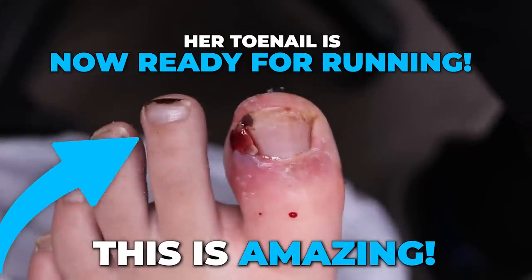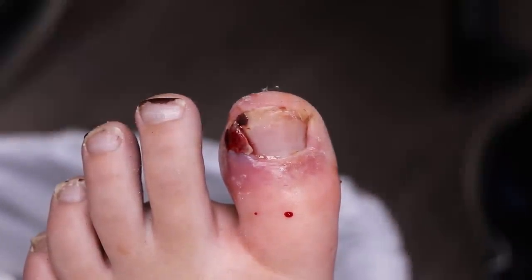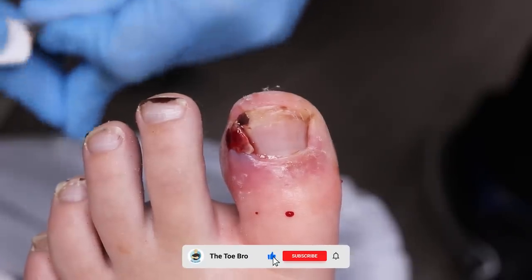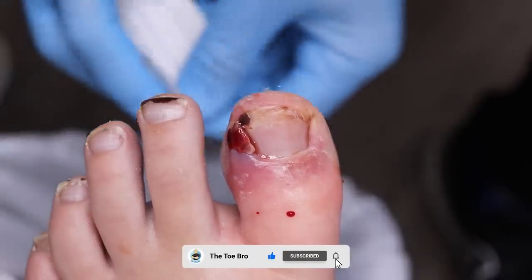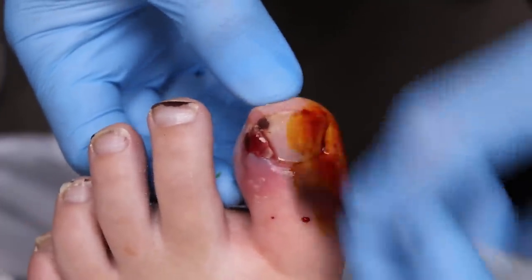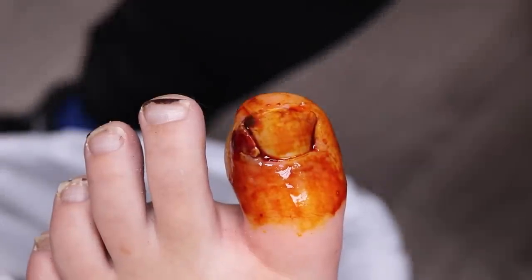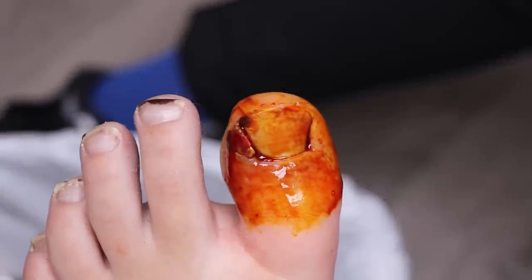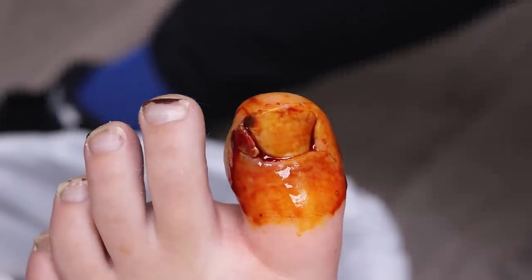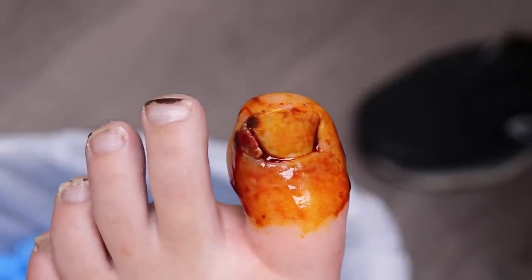The bloody sock — did you catch it on the bloody side? Oh, you're brave. I've done this a few times already. So this is the antibacterial ointment — iodine. I gave you a little bottle of that, that's what you'll be using week two. Week one will be antibiotic cream, something a little bit stronger. That was a little bit tricky to numb but got it done.